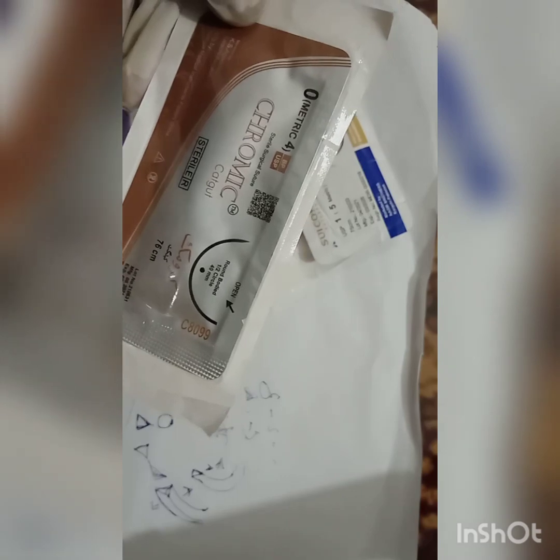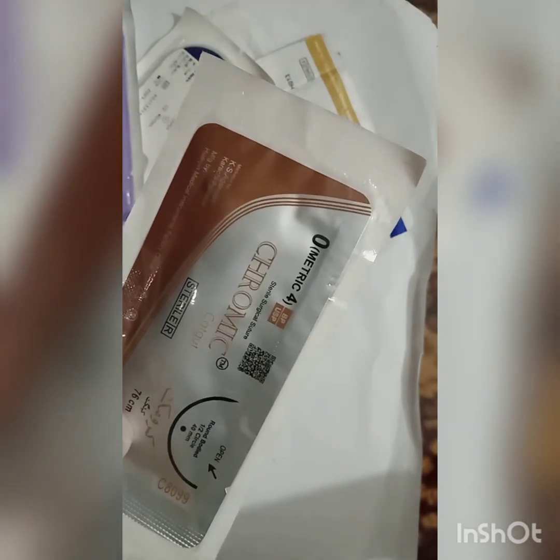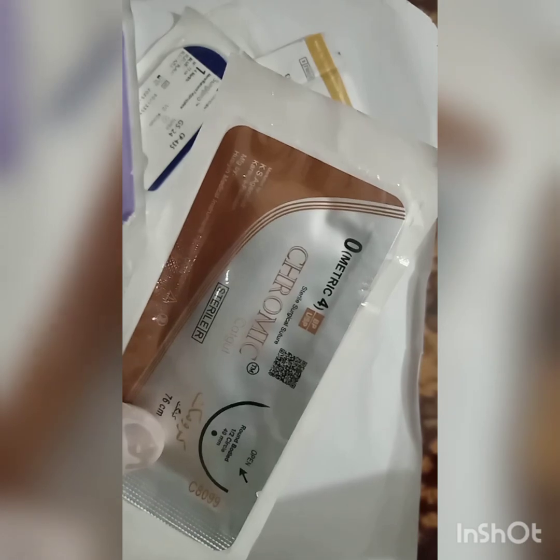And then the vicryl for the soft tissues, subcutaneous tissue closure, or gut anastomosis, the ligation of the vessels and tissues. And chromic catgut is nowadays less likely used, but can be used for the soft tissues, subcutaneous closure. Initially it was used for the gut anastomosis also, and other soft tissues.